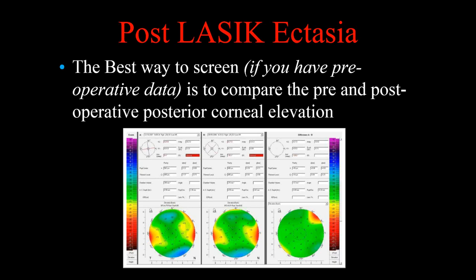So I've got to be honest with you and say I don't have that strict criteria that I do have for LASIK. I will say that clearly there are borderline cases that I may not do LASIK, I'm very comfortable doing on surface. With that, a final D value of 2.25 and above is a major concern regardless of, let's say, anyone 40 and below. And a value of 2.7 and above is a contraindication for me to do anything.